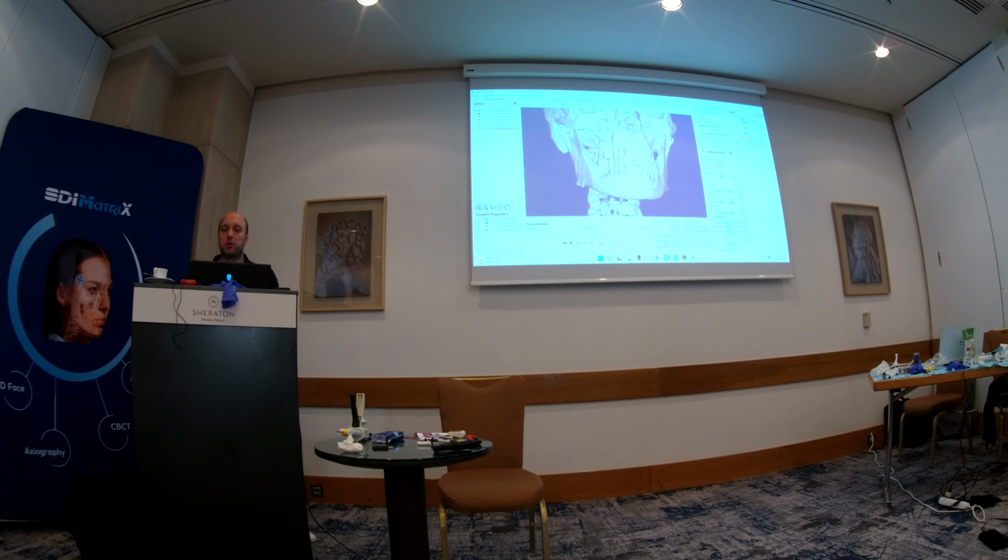The next points are the prosthetic plane points.